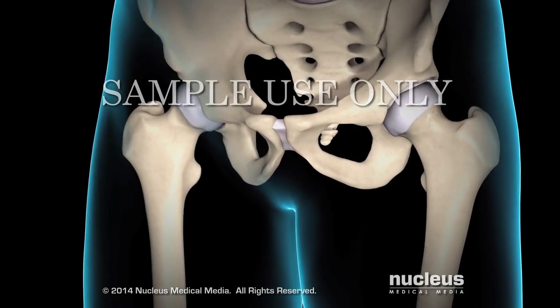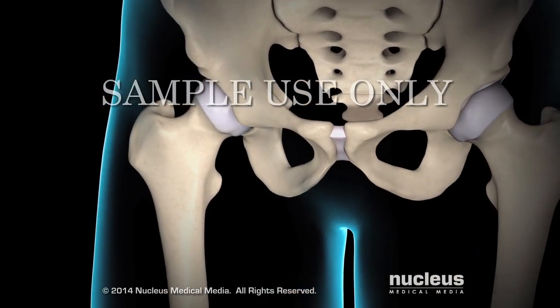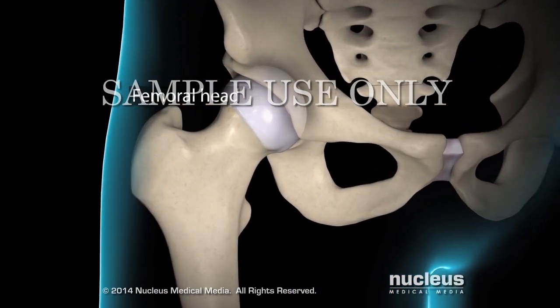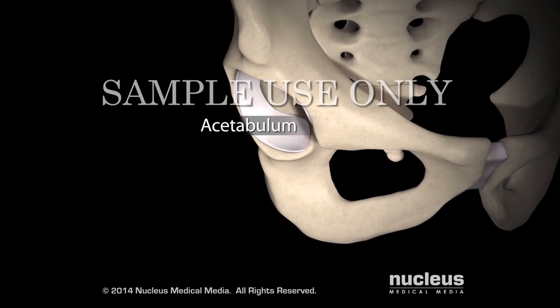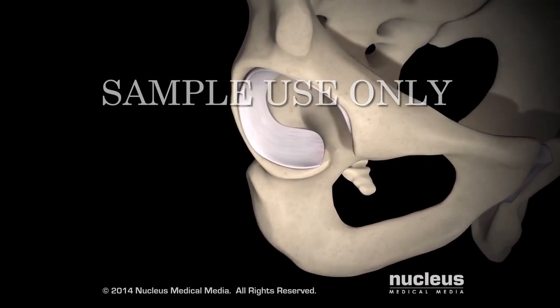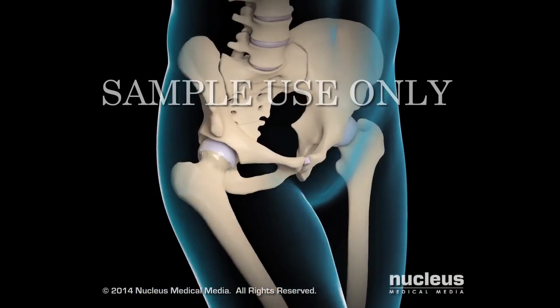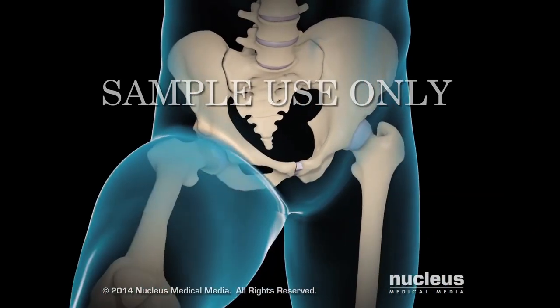Your hip consists of two main parts that fit together like a ball and socket: the femoral head at the top of the leg and the acetabulum in your pelvis. Cartilage between the femoral head and acetabulum provides cushioning between the bones and allows for smooth movement.